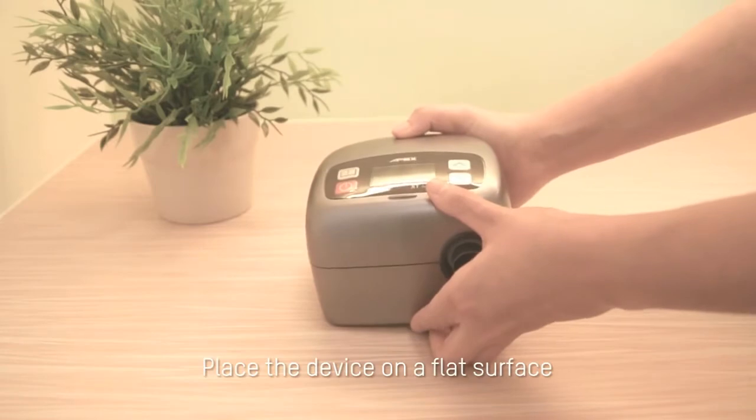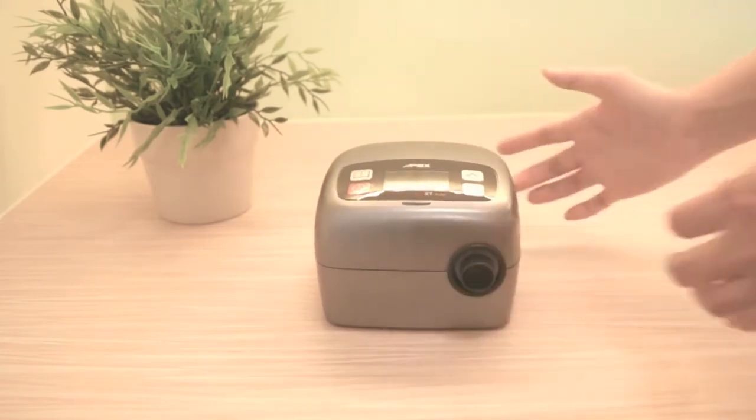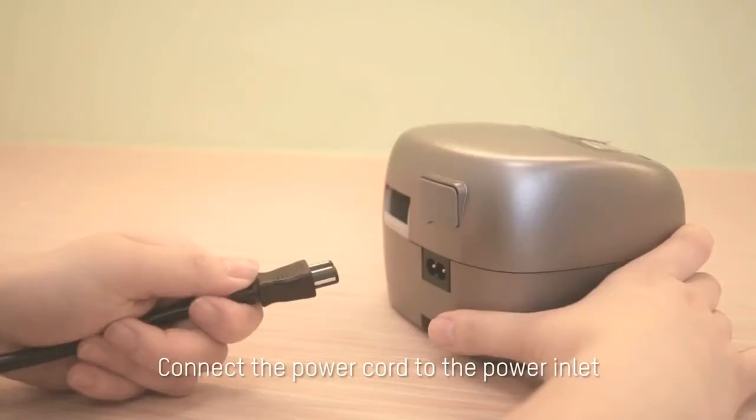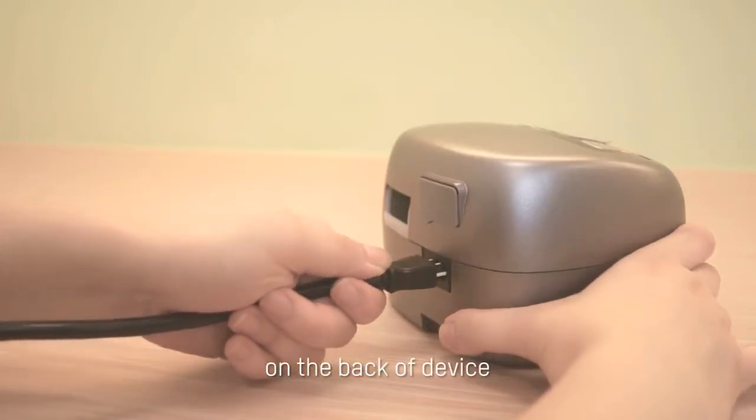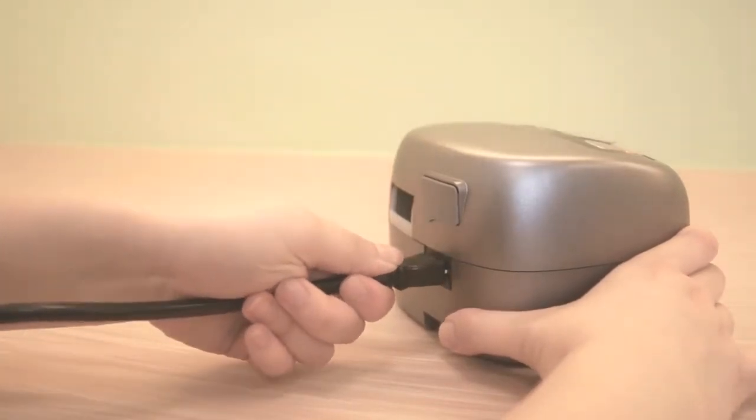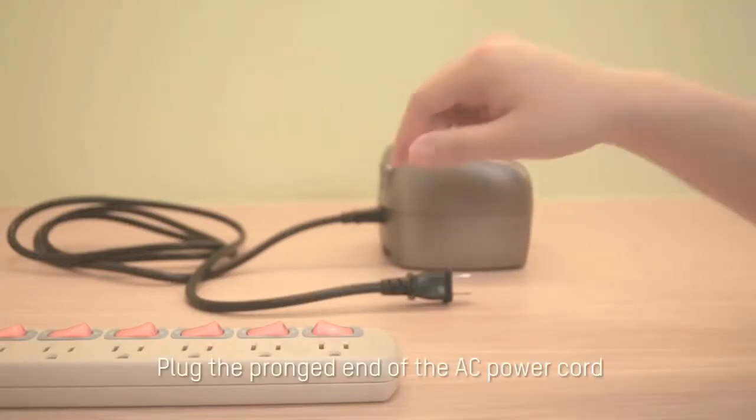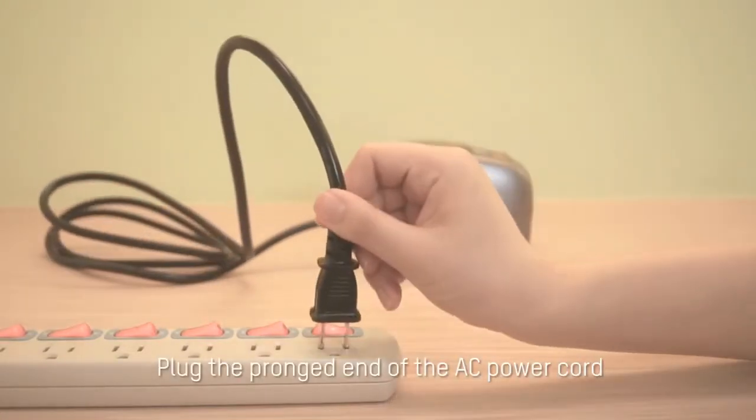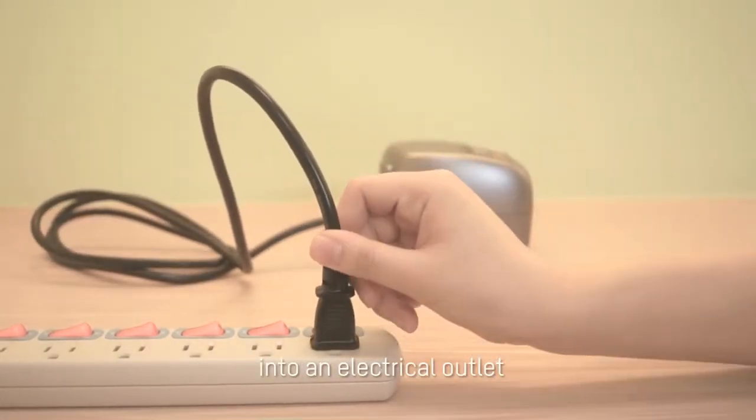Place the device on a flat surface. Connect the power cord to the power inlet on the back of device. Plug the pronged end of the AC power cord into an electrical outlet.